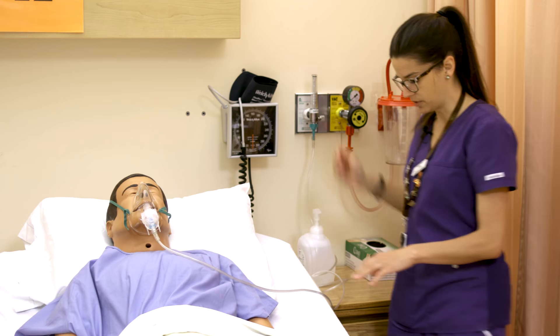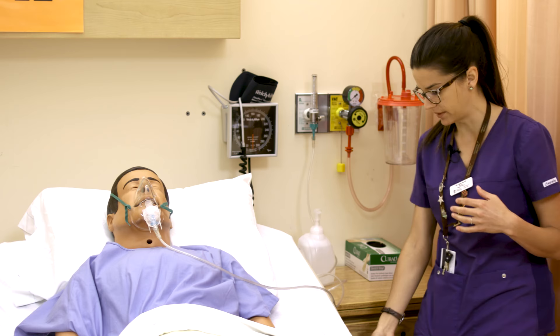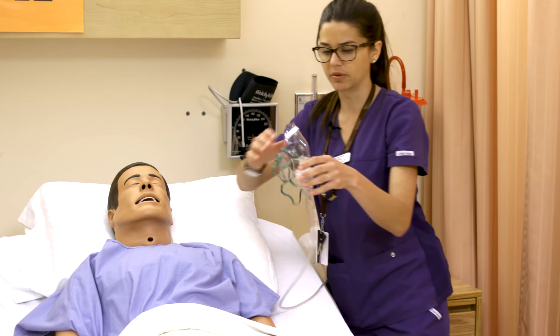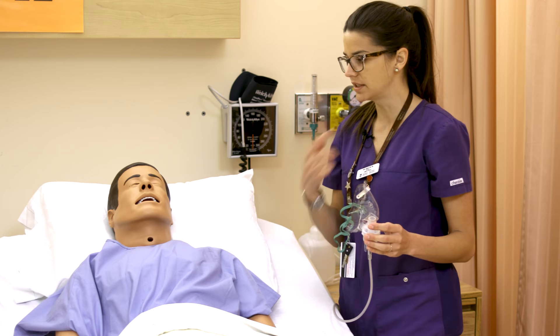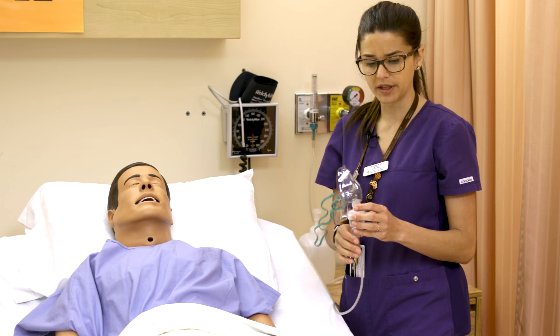A couple of important points with a nebulizer: as with any oxygen delivery, if the patient's condition can tolerate it, have them sitting up. This helps them take full deep breaths, expand the lungs, and get the medication as deep as possible. Also, because the medication is inhaled through the mouth, advise them to rinse their mouth and spit afterward — especially important with steroids, as they can cause oral thrush.